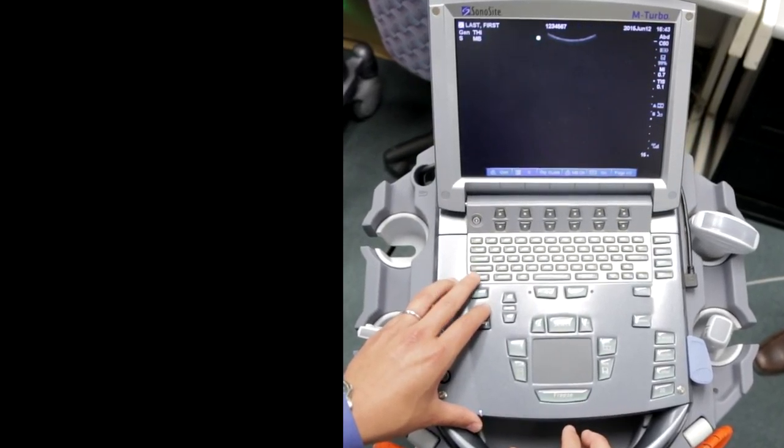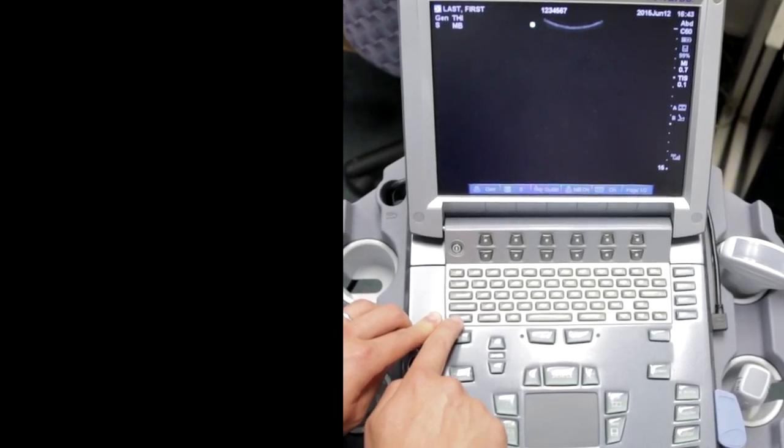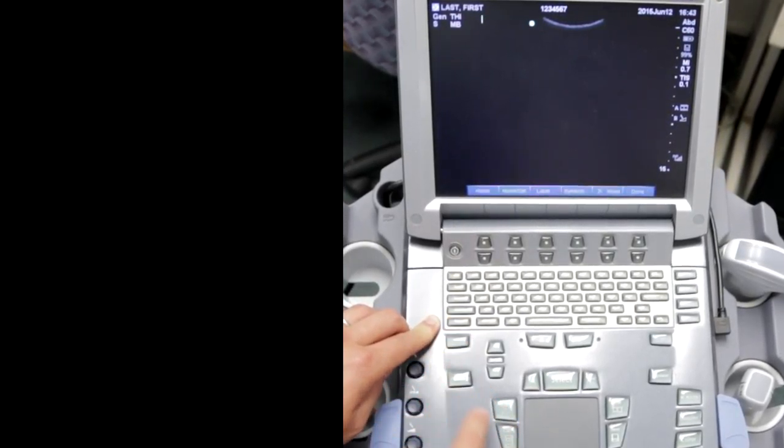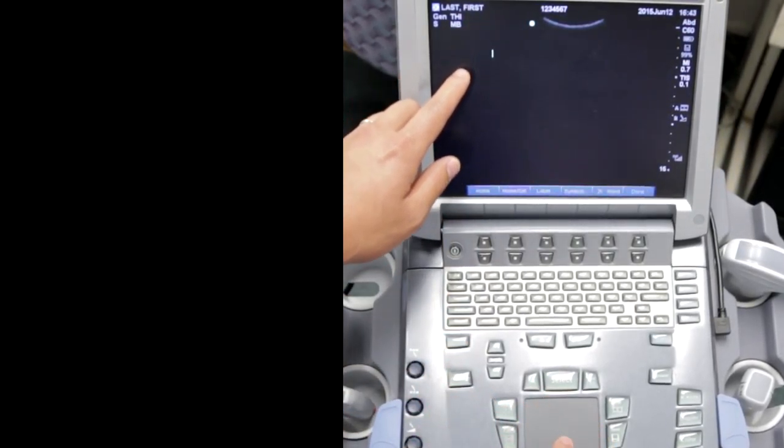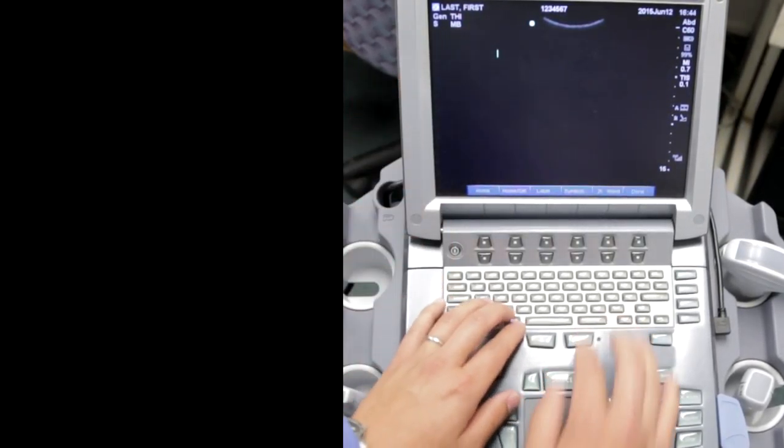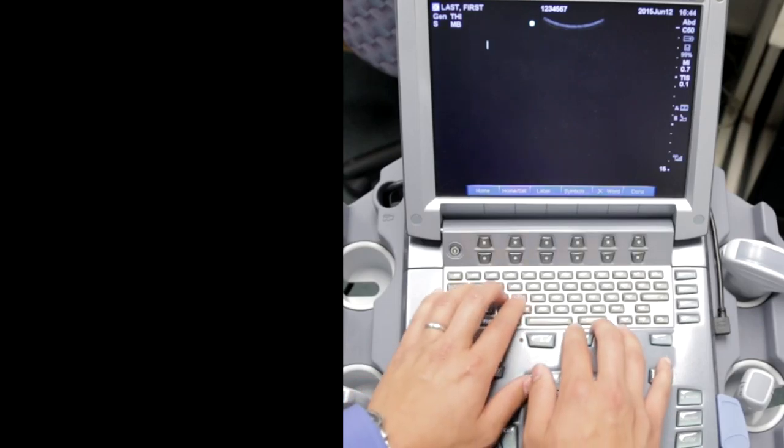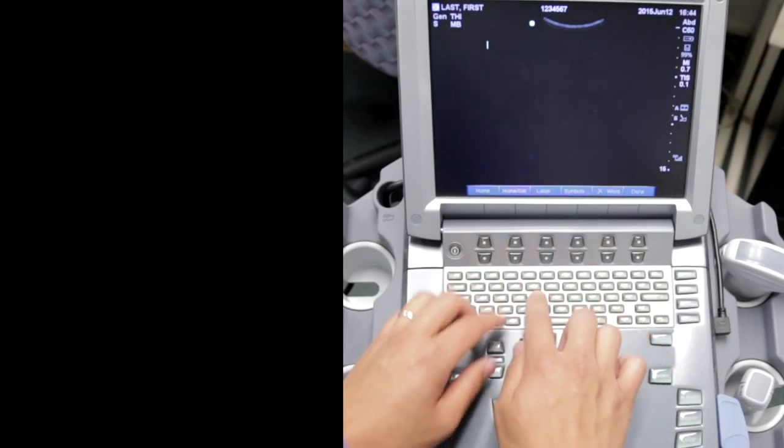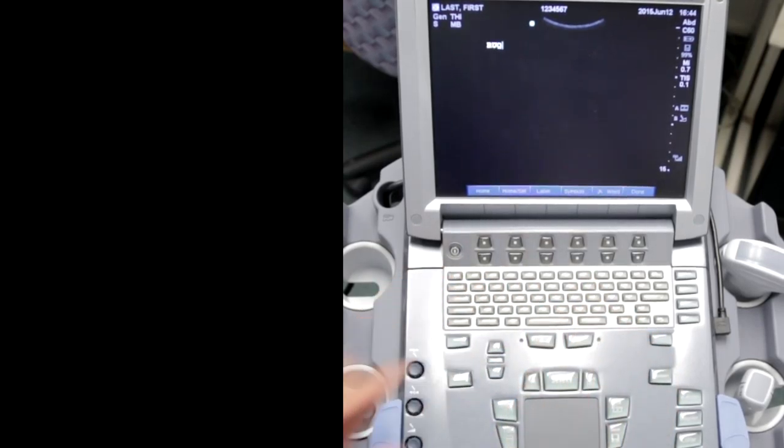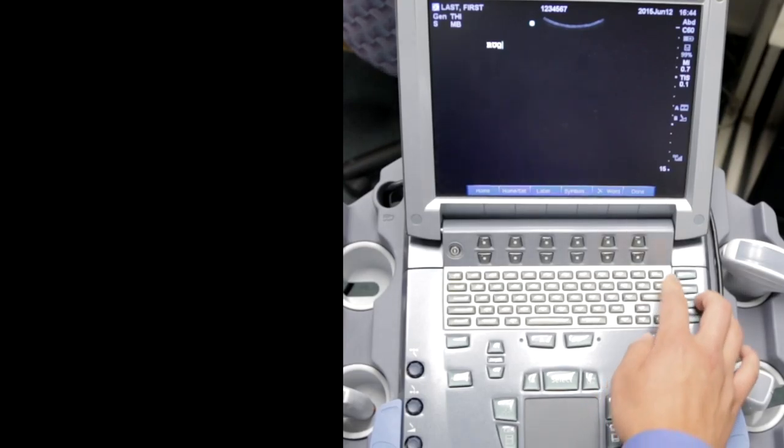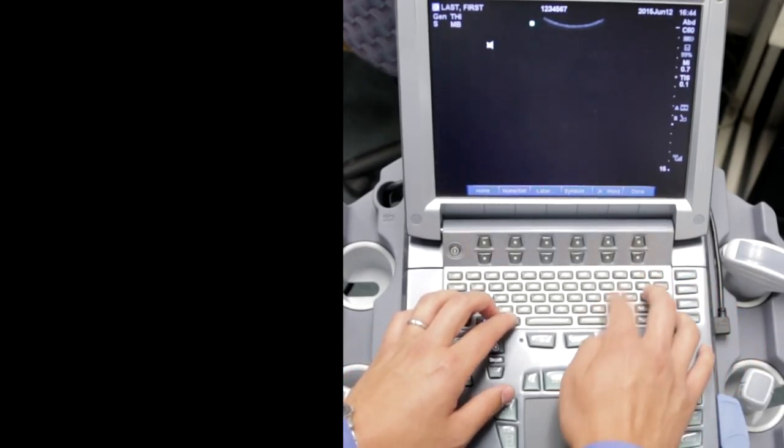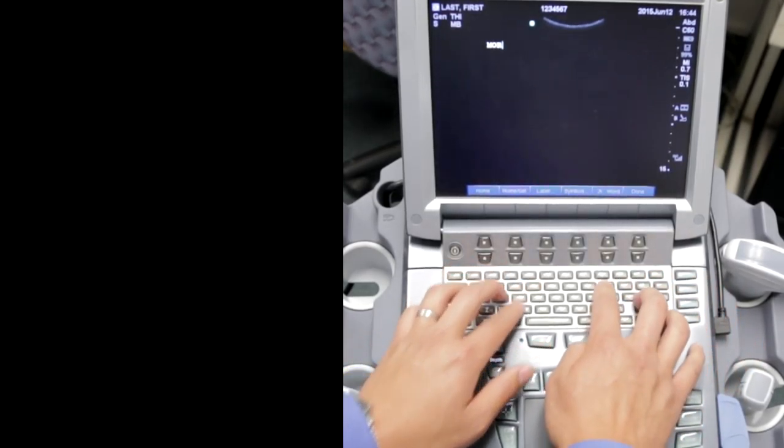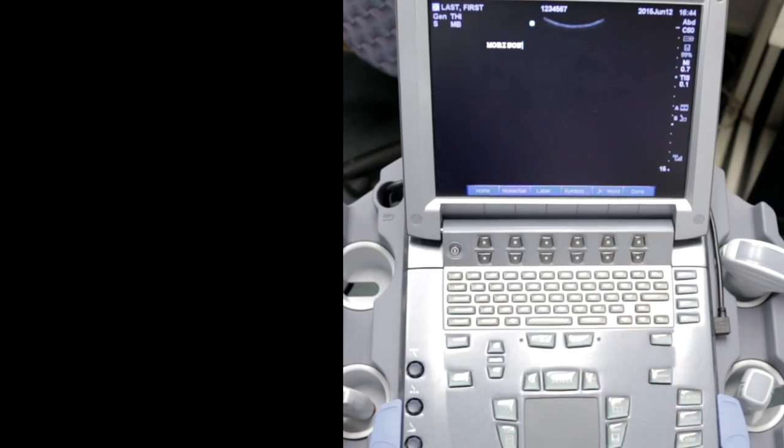If you want to comment, there's a text button on the bottom left. You push text and the cursor appears, then you can drag where you want the comment to start. Let's say you're doing a FAST scan, this is the right upper quadrant. You can put RUQ or Morrison's, then save your desired image.